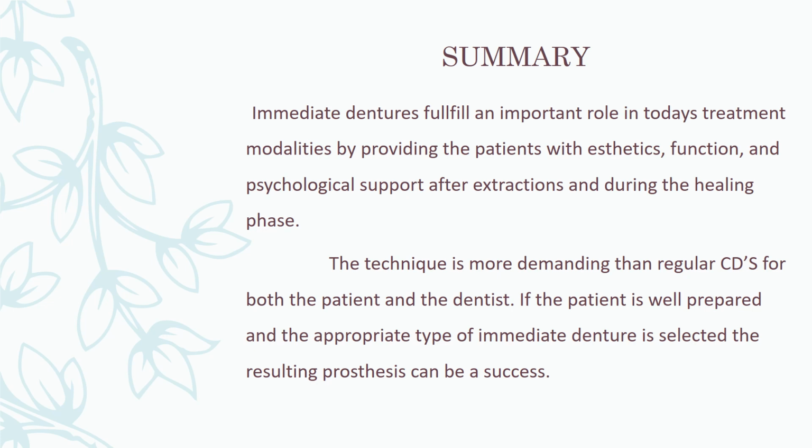If the patient is well prepared and the appropriate type of immediate denture selected, the results can be successful. So basically, guys, if done well, the patient will be satisfied. But yes, triumphs are not possible in all types of cases, and in most cases a reline has to be done.